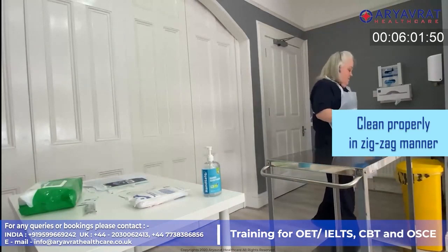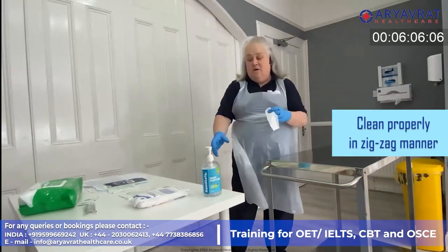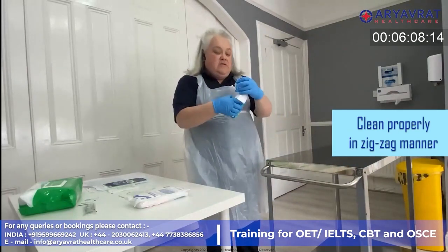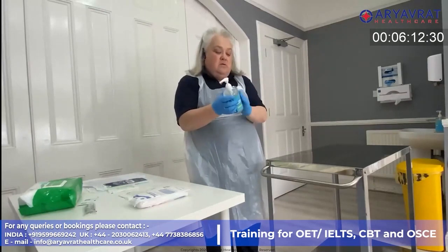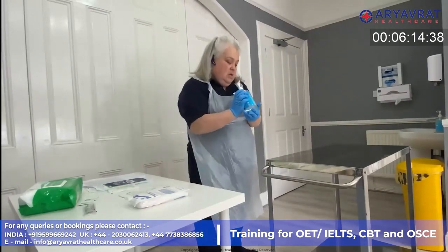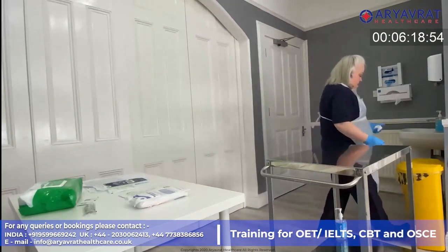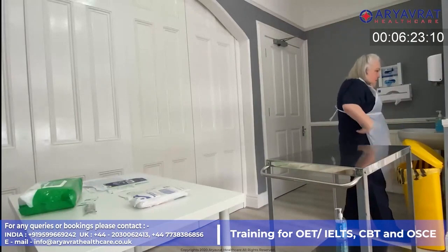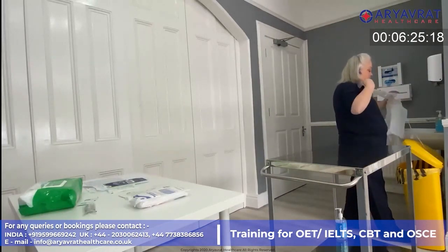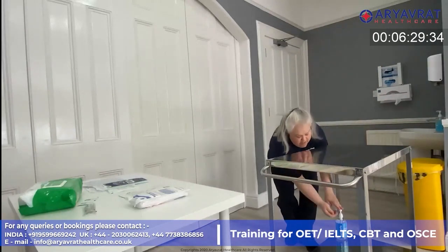Going to discard all of that. Finally, with my last wipe, I am going to clean the spout with my alcohol gel and place that on the bottom of my trolley. I'm going to discard the gloves and apron and do my hand hygiene.